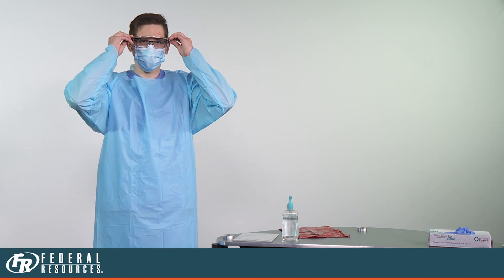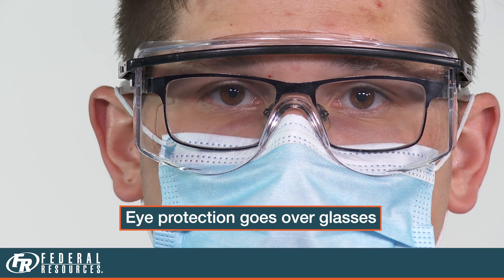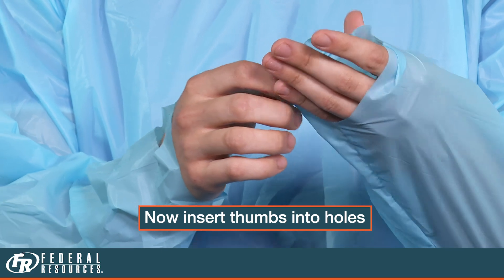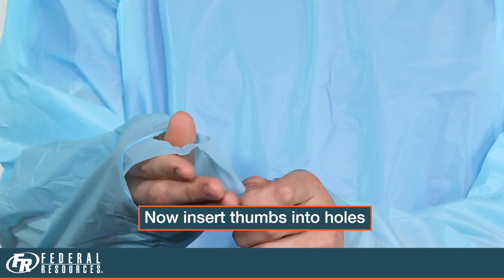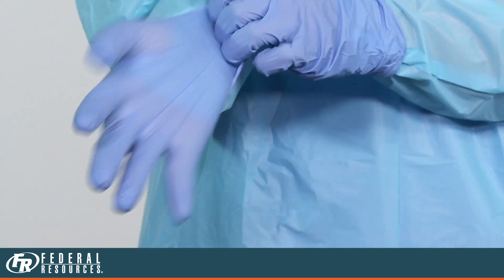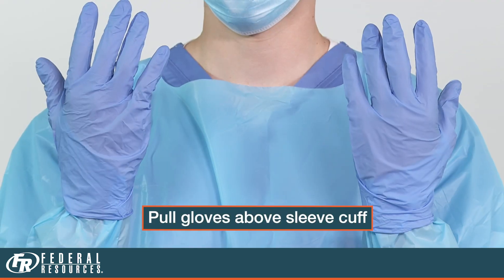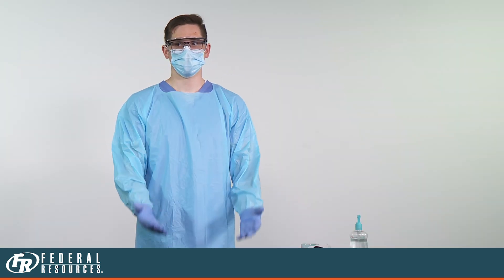The next step is to put on your eye protection. If you wear glasses, your eye protection will go over your glasses. You are now ready to put on your gloves. Prior to putting on your gloves, insert your thumbs into the thumb sleeve holes. Put your gloves on as you normally would. The key here is to pull the glove above the cuff of your sleeve. Ensure there is no skin showing between your glove and the gown. You are now ready to safely perform patient care.